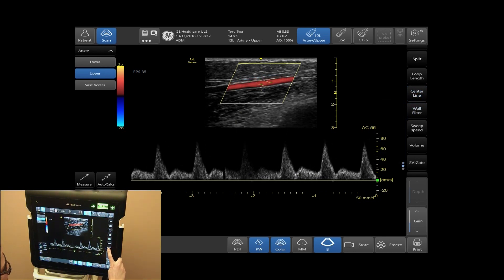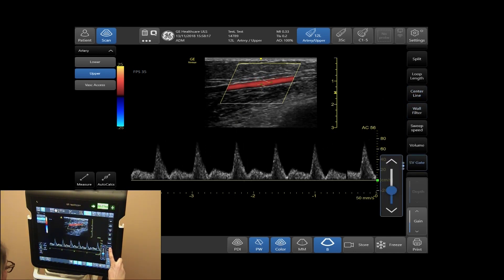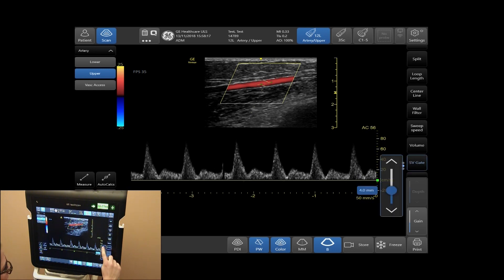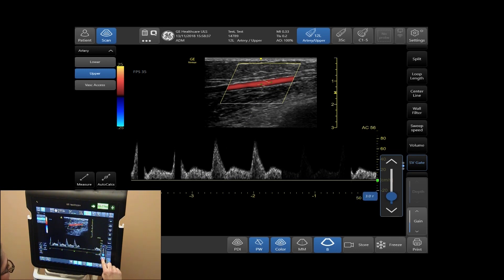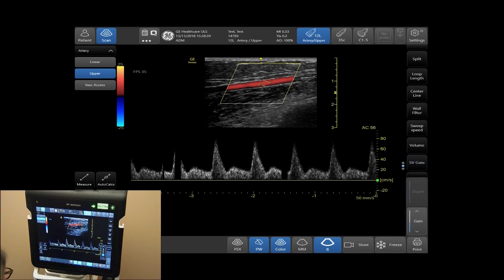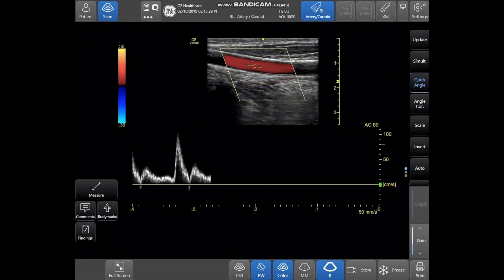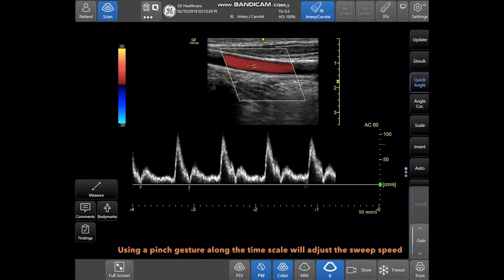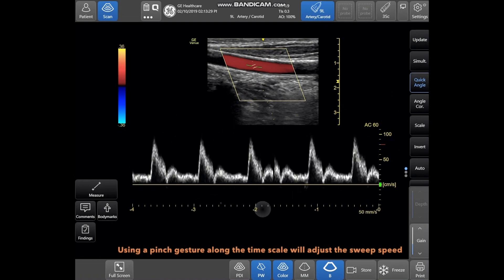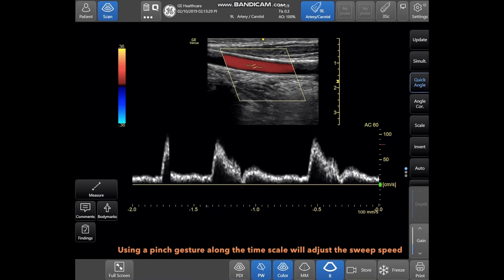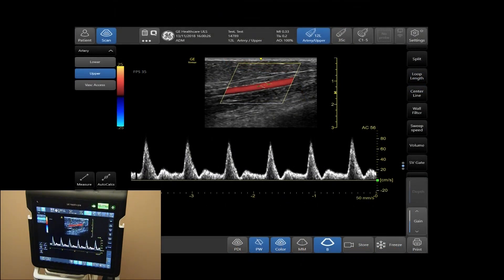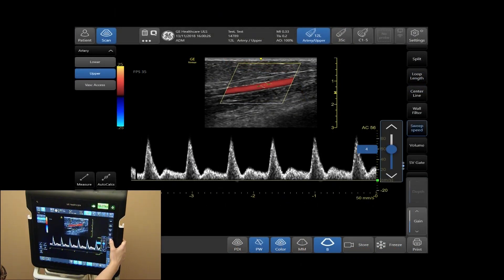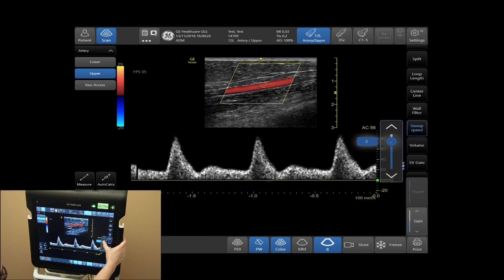Your SV gate tab will allow you to increase and decrease your sample volume gate. To increase and decrease your sweep speed, tap Sweep Speed to increase and decrease.